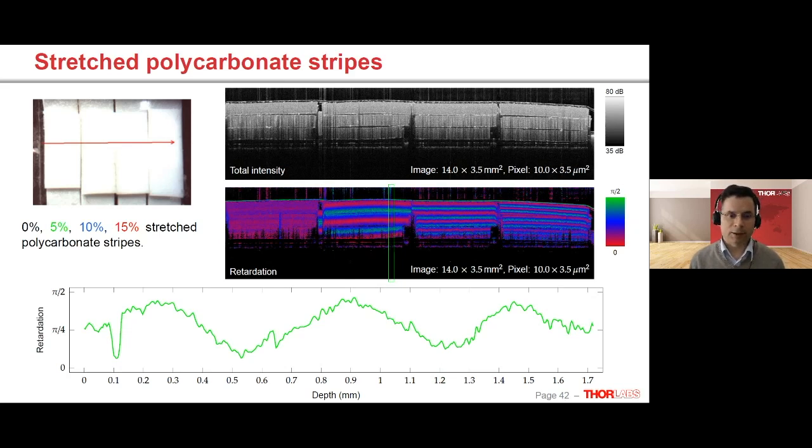That could be layer by layer, but if the sample had some homogeneity that you can use, then the slope of this curve will be given by the retardance, and this curve is actually wrapped. This is why it looks up and down, but it's actually one single curve that started here, goes up, and then this is the way it's going.